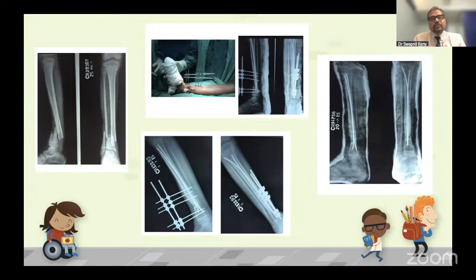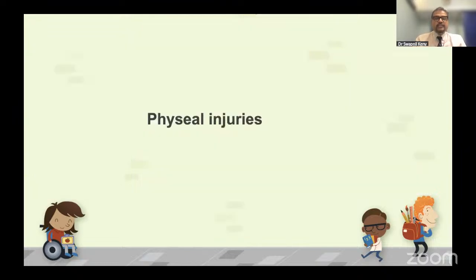And what happens is once the wires are out, usually the holes which are there because of these wires tend to fill up, because you're not actually damaging the bone by doing thermal drilling. This is a low intensity exercise of putting the wires because it doesn't cut across, it doesn't make a channel across the bone, it just makes a small thin tunnel which eventually heals up very fast. So if you see a distal radius fracture which you pinned, or any other fracture you've pinned, and if you call the patient after 6 months, you will not be able to see the tracks of the K-wires because most of these tracks tend to heal up and fill up eventually with new bone formation. So that is where we are as regards healing of this particular fracture.